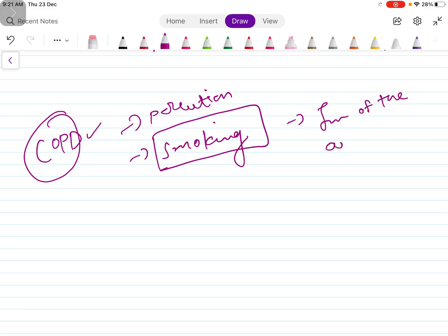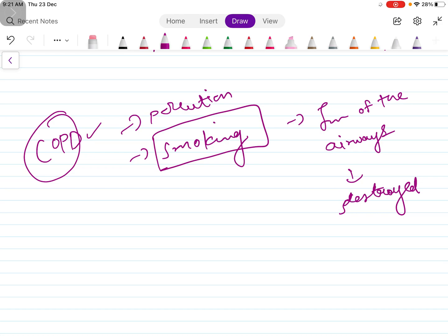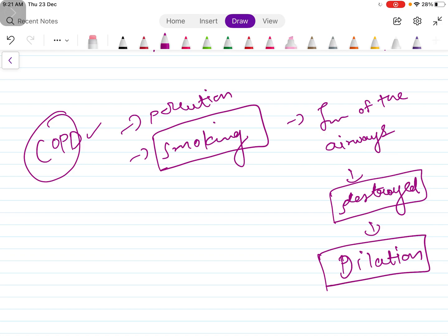With time these airways get destroyed. There are elastic tissues and smooth muscles that get destroyed and there will be dilatation of the airways, and that is a permanent dilatation.